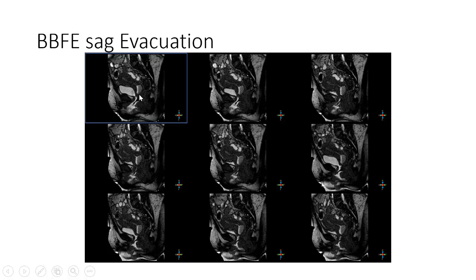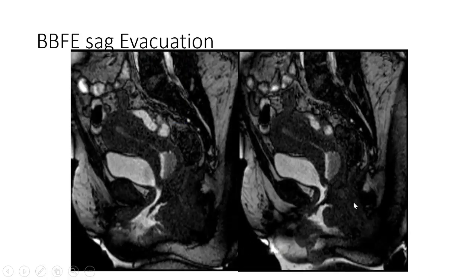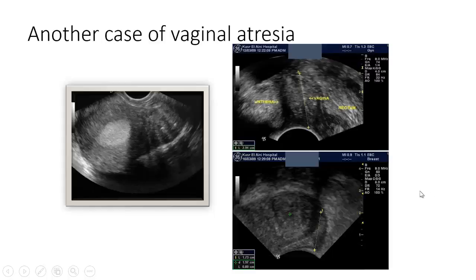It is a high confluence here between the upper vagina and upper urethra. So this is high confluence and not low confluence as in the first case. And here we inject gel in the lower vaginal pouch. This is a lower vaginal pouch not communicating with the upper one. But here is high confluence of the urogenital sinus syndrome, where we found confluence between the upper vagina and urethra, and this is nicely seen on micturating MRI. Thin cuts.